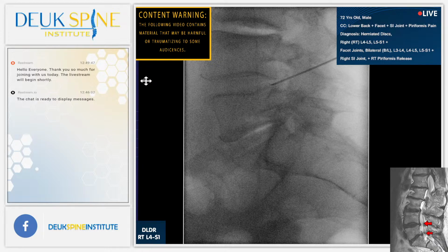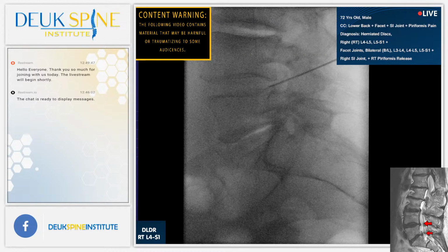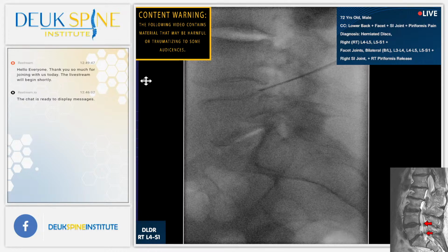Is he awake? How are you? You all right? Open your eyes for me. How are you? You okay? We're going to ask you some questions. He's waking up nicely. I may just want to put him back to sleep. Okay. Let's see. Hold on. A little bit too, right? Might relax him a little bit to go back to sleep. Shot.